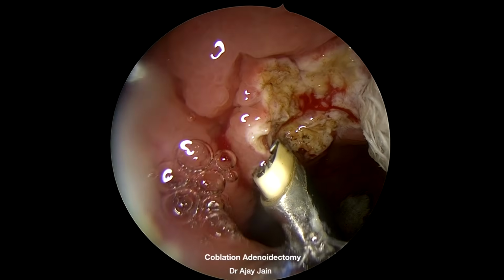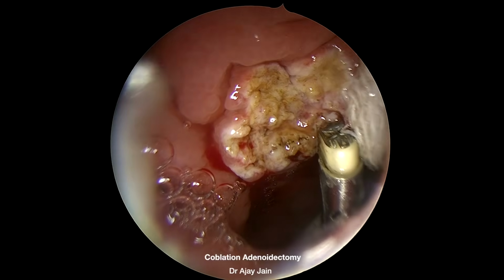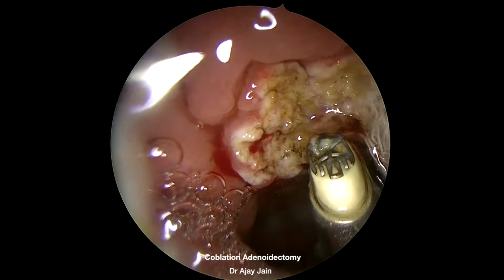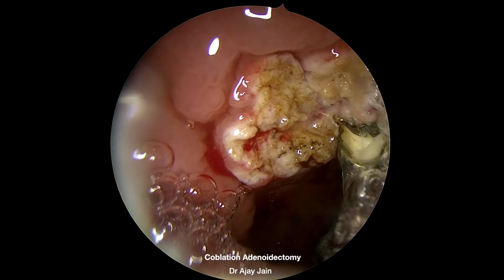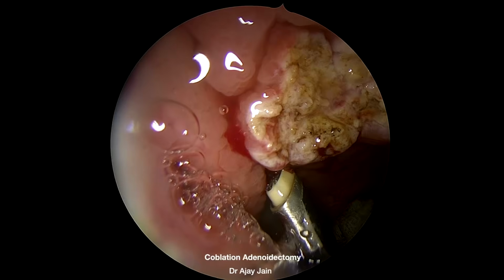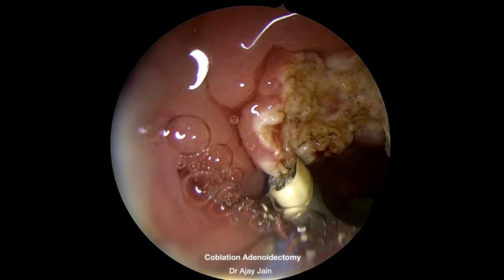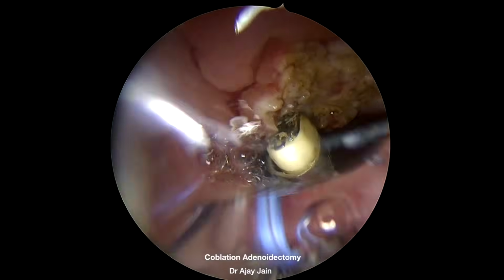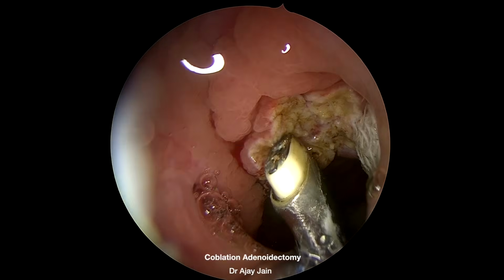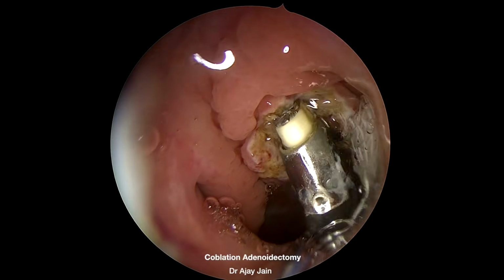Notice how the adenoid tissue is being ablated under continuous saline irrigation. Adequate irrigation is essential. It keeps the operative field clean, prevents lens fogging, reduces tissue charring, and prolongs the efficiency of the coblation wand. Bleeding points are identified immediately and coagulated individually. Early control of every bleeder maintains a clear surgical field and reduces operative time.